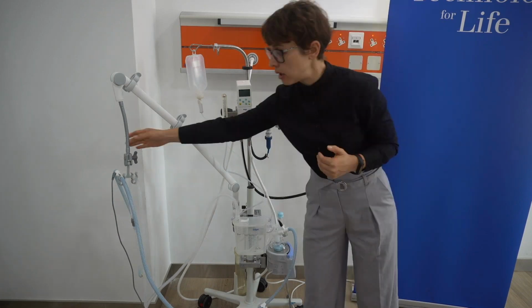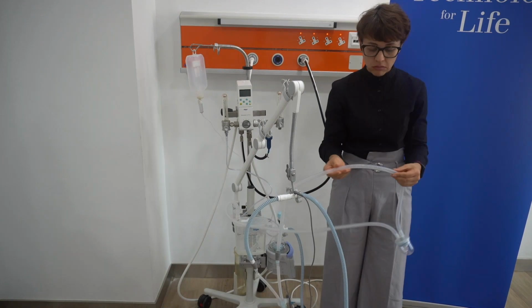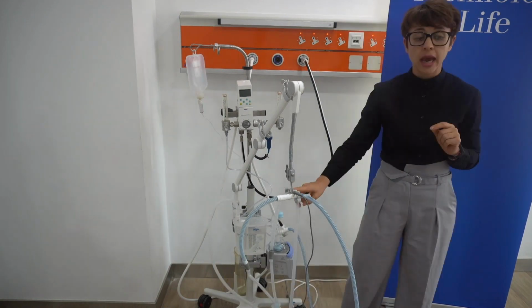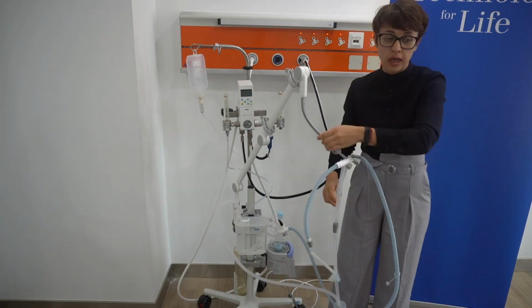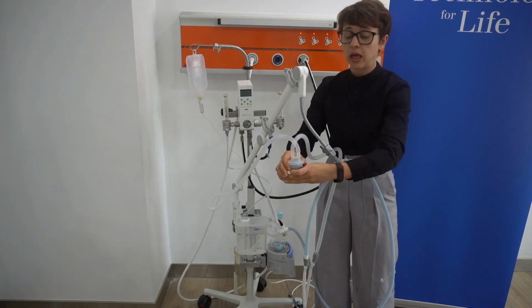And if we look at the setup here, we have a simple circuit. And considering that the expiratory circuit here is not humidified, it is also important to have the water trap.